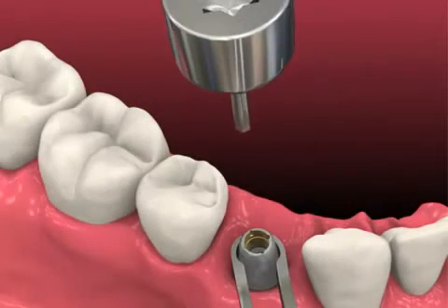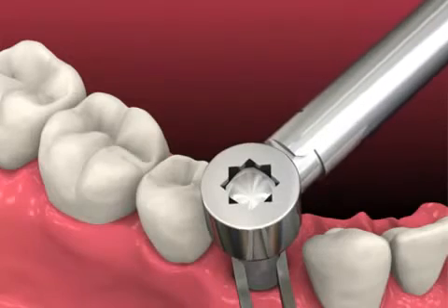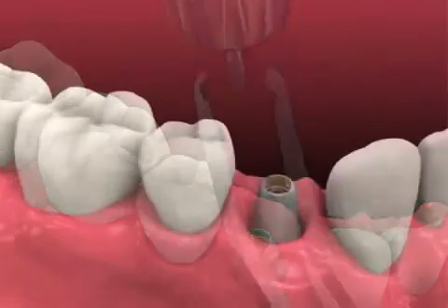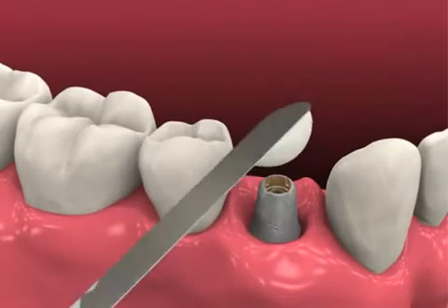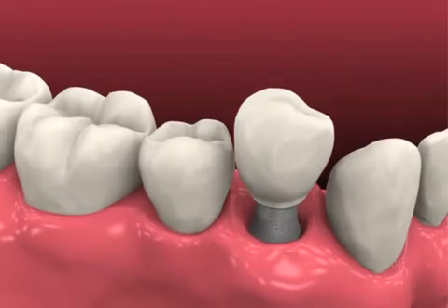Apply 30 newton centimeters of torque to the abutment screw with a calibrated torque wrench. An abutment clamp may be used to help shield the bone-implant interface from excessive stress. Fill the screw access channel with a resilient material to prevent the ingress of cement.